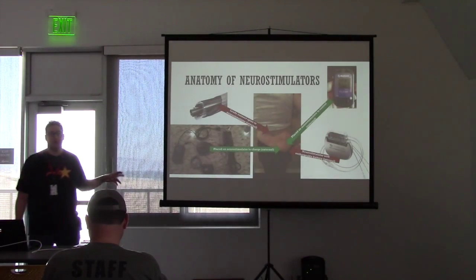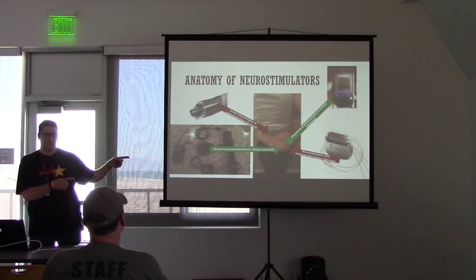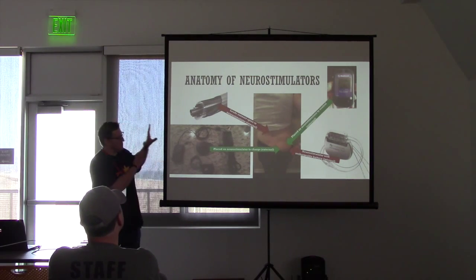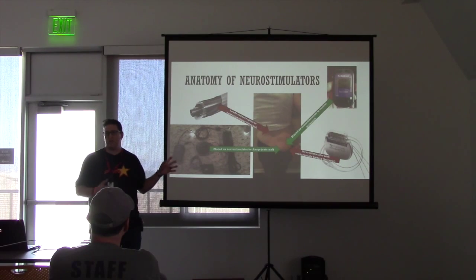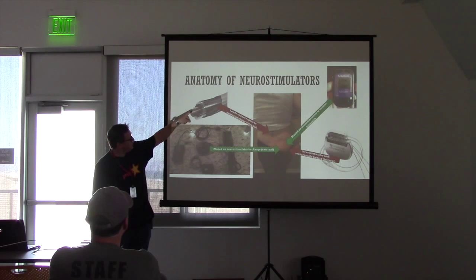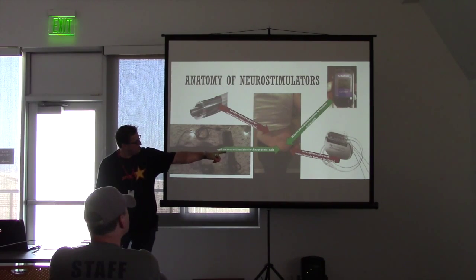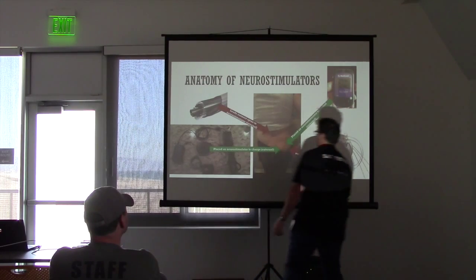So, I showed you a cartoon a minute ago. This is the real thing. That is my wife, and she did approve this picture. So, there's a lot of parts here, and I'm going to explain it because this is the entire thing that she has to deal with on a daily basis. So, these are the leads. They basically, as I said, run from these pain management devices here into her spine. And so you'll see two incisions.